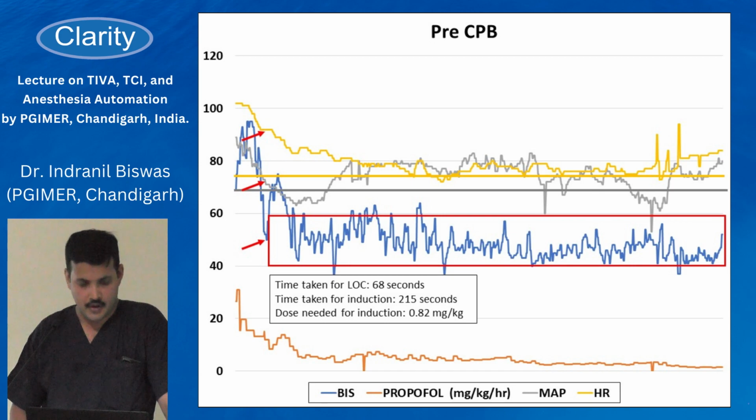This was the MAP at induction, and this was the heart rate at induction. After that there were some fluctuations at that time also.